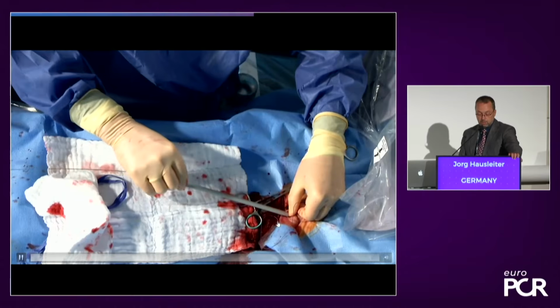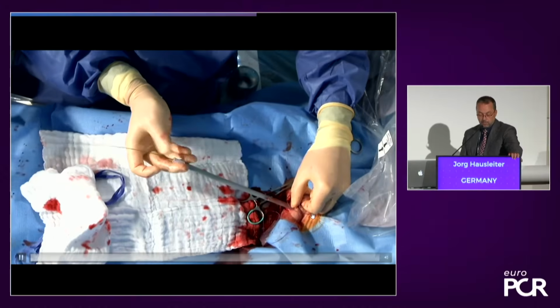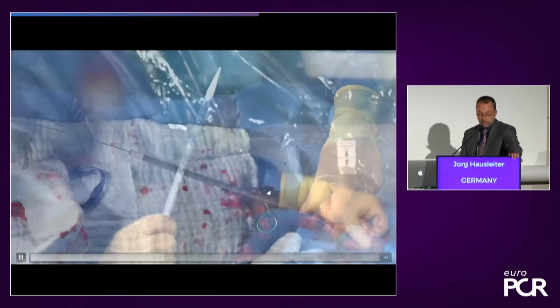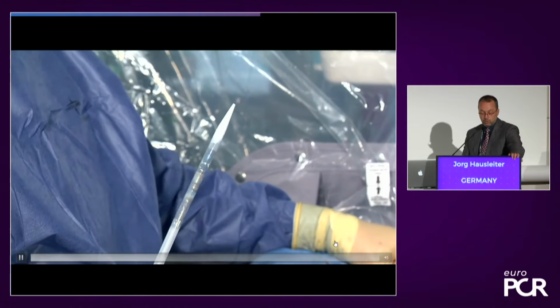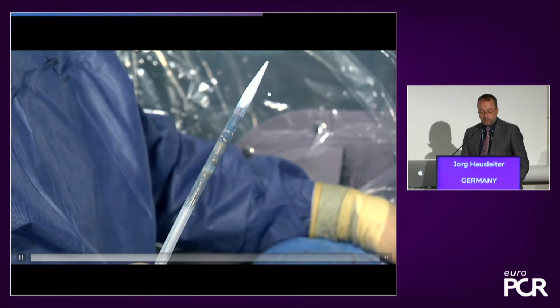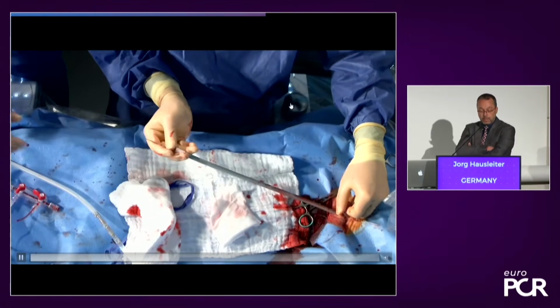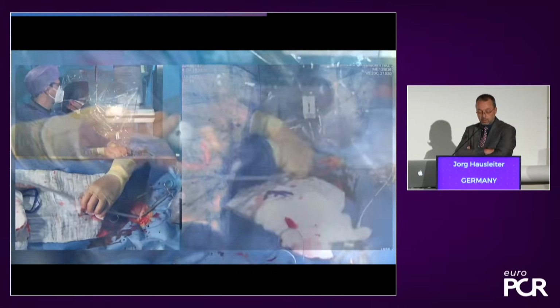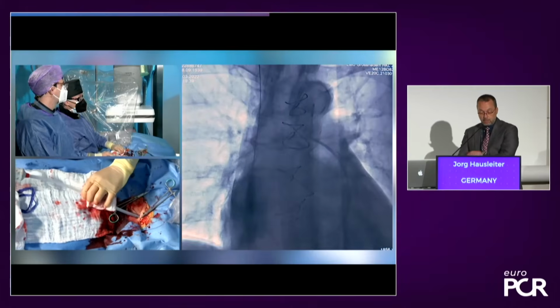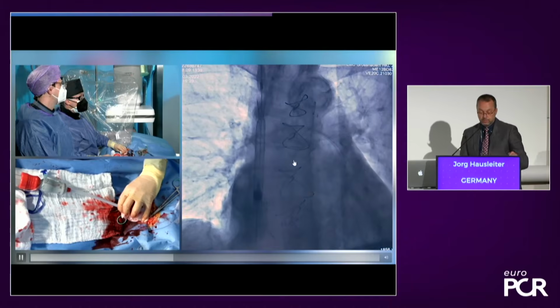Usually this is without any problems. And with each taking out of the dilators or changing, I pull on the sutures so that we have no blood. You see here the nice system, the tip of the catheter, the pre-mounted system, so it comes already everything is prepared, it's a dried bovine pericardial valve. And then here you see how easy the system can be introduced.